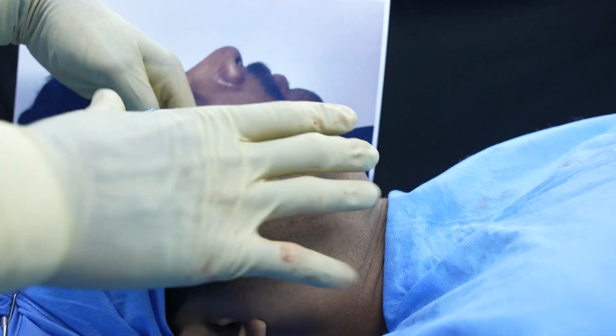So I said he had a short square face like this. So now we've made it angular, and we've also made it much longer in the anterior region.